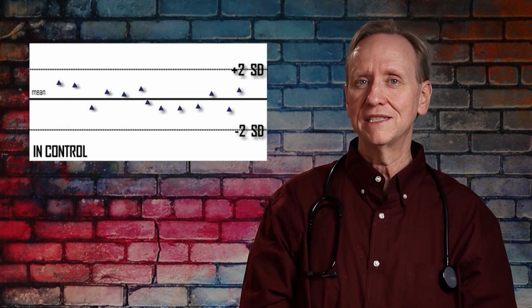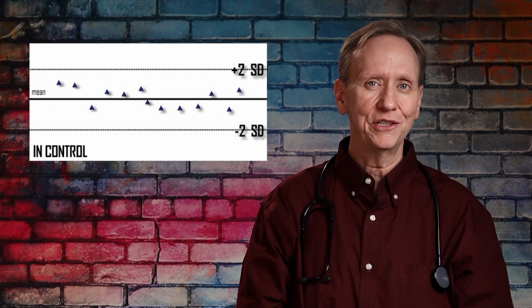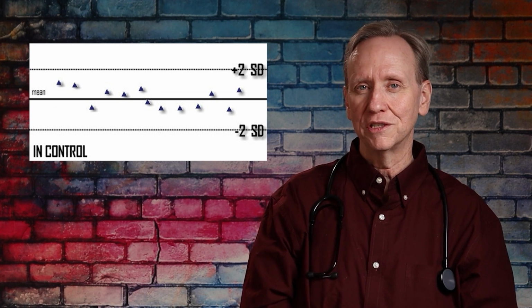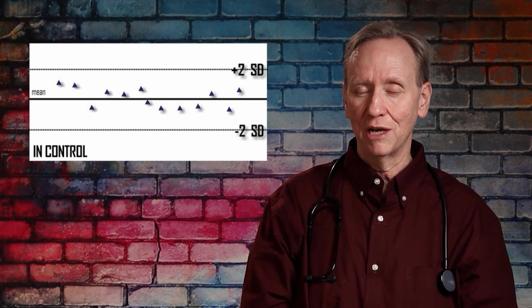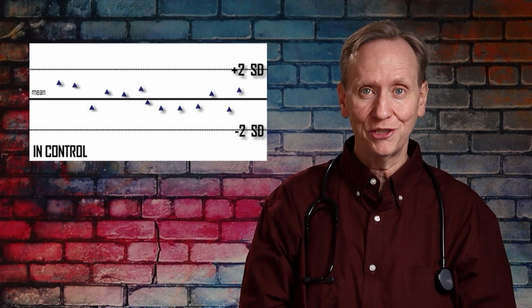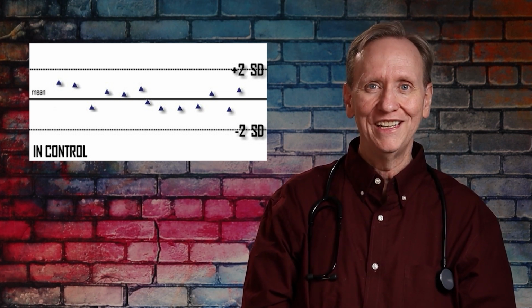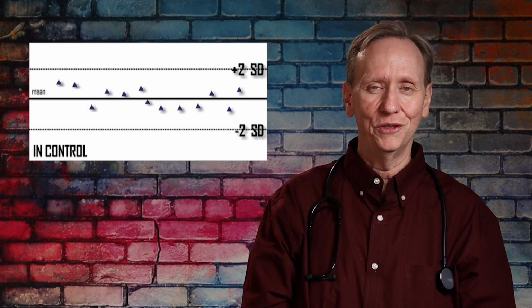What we would say is that it's got a little bit looser control than the first one. The first one had a little bit tighter control because the points were very close to the mean. That just means that machine is operating with fairly high amounts of precision, and one might also say accuracy. But both, including this one where the points are spread about, are considered in control.